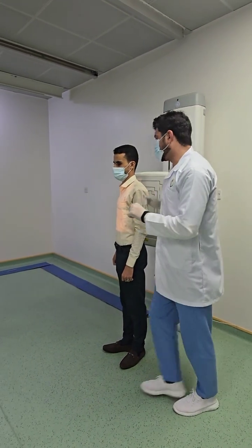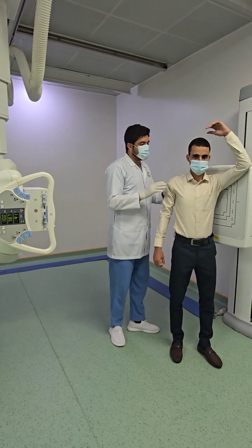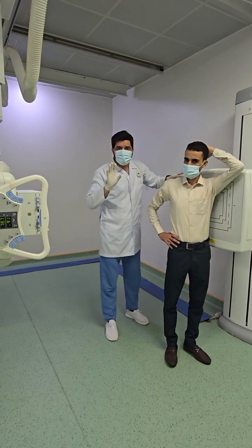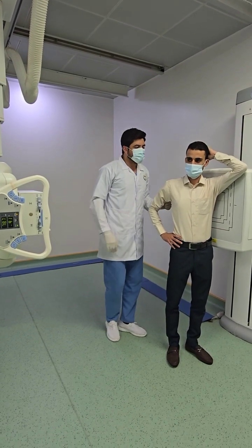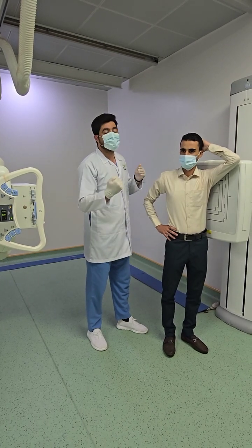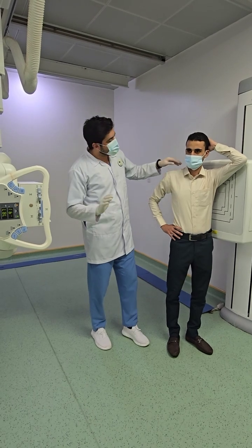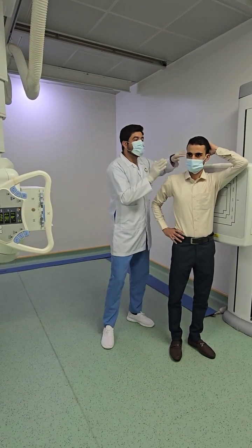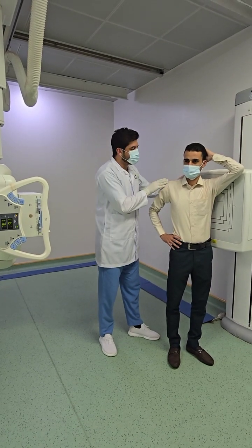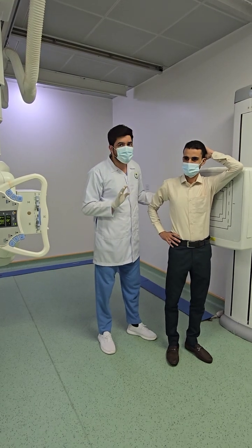Okay. Now another one. Left posterior oblique. In the left posterior oblique, the posterior side is near to the detector, so P we will take first, posterior. Now we will look for which side is near to the receptor or attached to the receptor. The right side is far away from the receptor. The left side is near or attached to the receptor. So we will take posterior and left side, and the body is oblique. So left posterior oblique position.